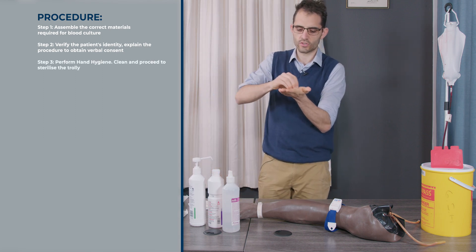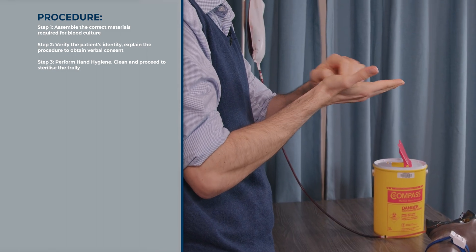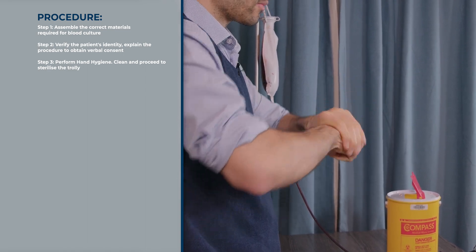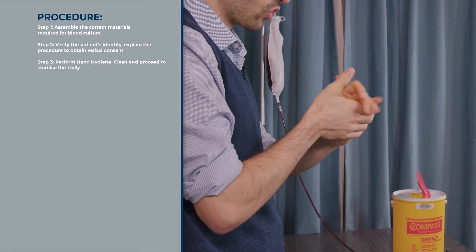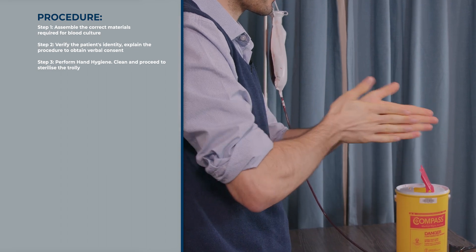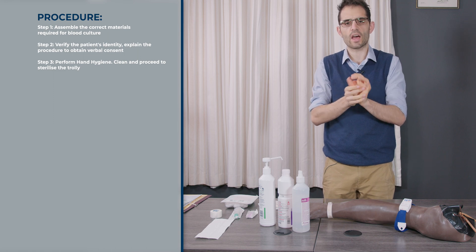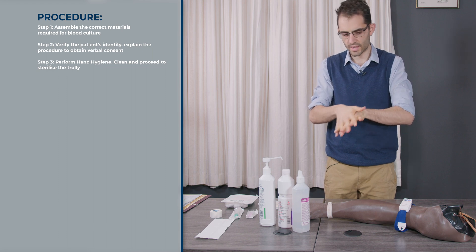Importantly, you need to do hand hygiene. Put one to three mils on your hands, start with your fingertips, and this should be done for 20 seconds. It's important that you do it for the correct amount of time because you need the alcohol solution to dry to remove the microorganisms that are on your hands. For the rest of the video I won't be doing the whole 20-second routine, so you can always refer back to this part.